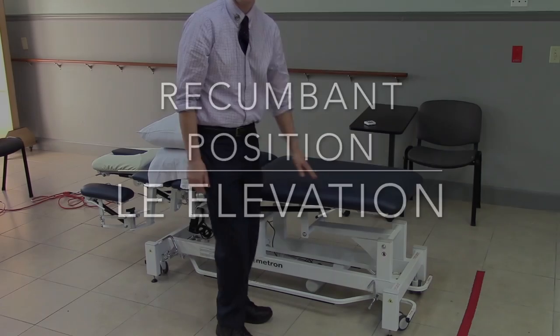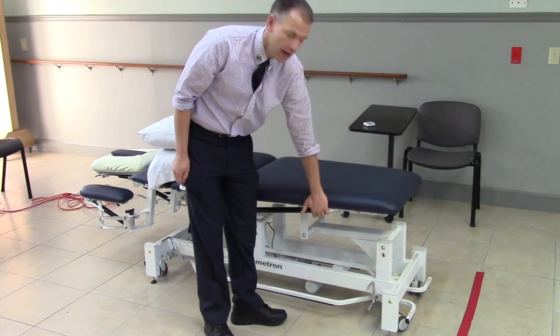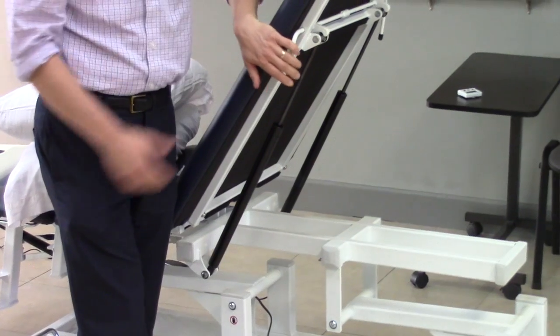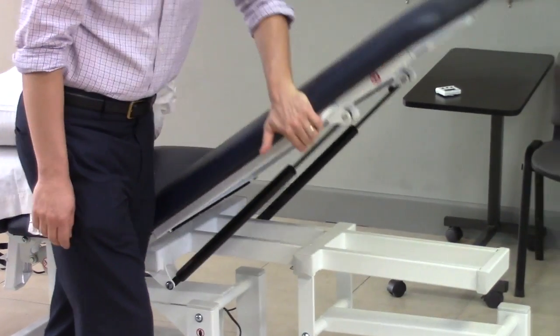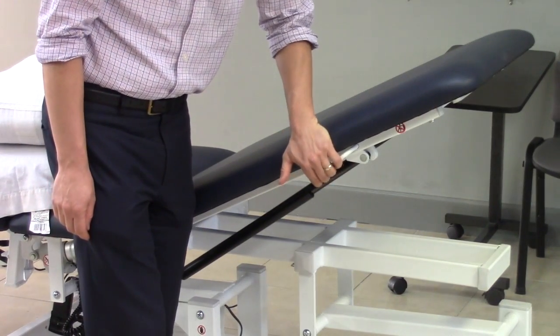The large section in the back is good for recumbent position or lower extremity elevation. There's a lever here which you can pull, raising the table. Pull it again, then push down, and the table returns you to a lower position.